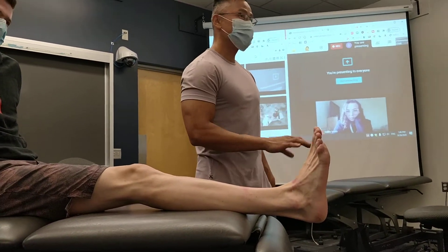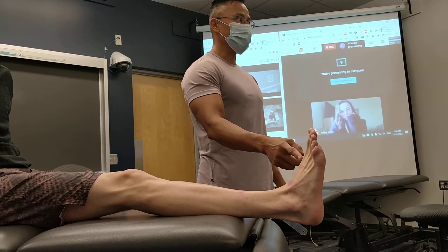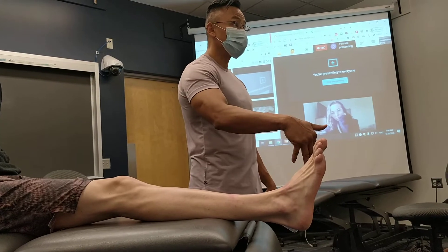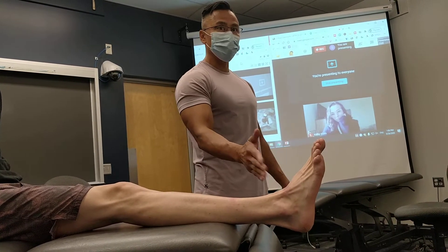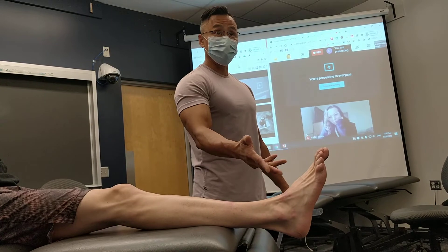That's 90 degrees — that's my theoretical starting point. So if they can't get to 90 degrees because it hurts too much and that's as far as they can go, then the difference between the 90 and here is the negative dorsiflexion. They're negative because they can't really get the dorsiflexion, so from zero to here, that's a negative number.